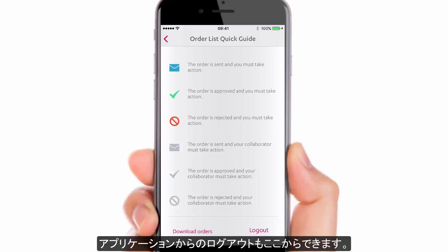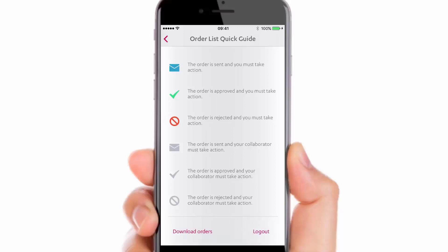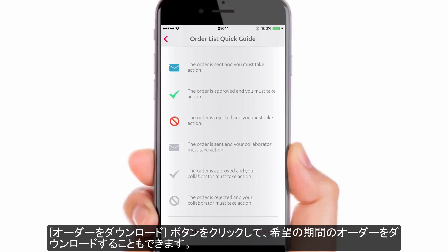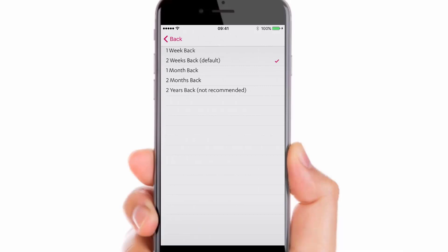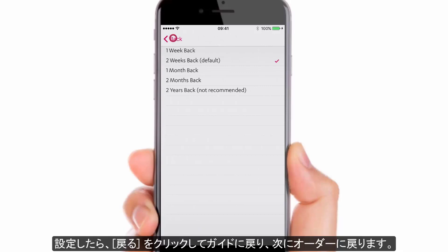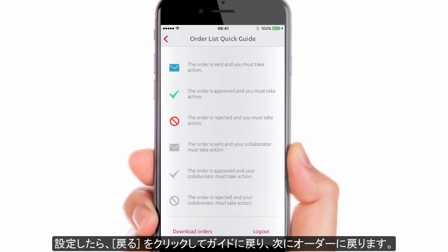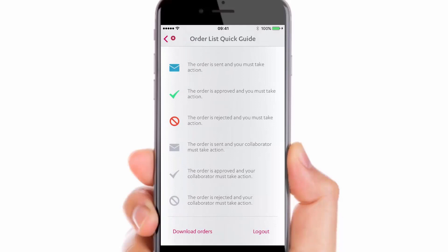It is also here where you can log out from the application. You can also click the Download Orders button to decide which time period you wish to download cases from. When set, just click Back to move back to the guide and then to Orders.